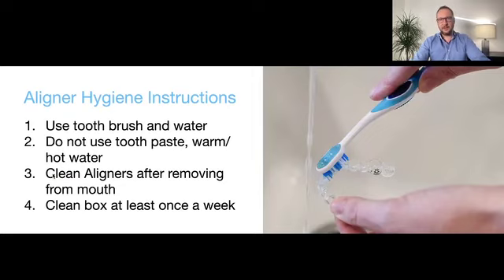I like to teach them, with the toothbrush that I give them, how to brush the aligner, how to clean them. And it's important to remind them, because they don't know these details that for us are kind of obvious, right? But just use toothbrush and water. I always ask them to not use toothpaste, because it has a lot of abrasive, there's a lot of... sorry, I'm missing the word, but all the toothpastes are very abrasive, right?